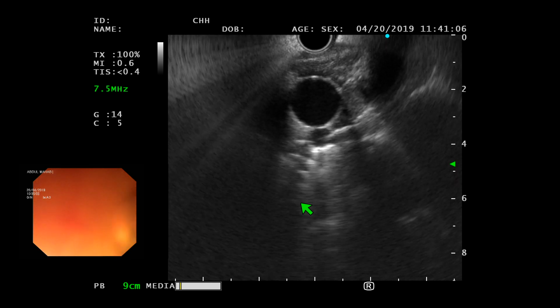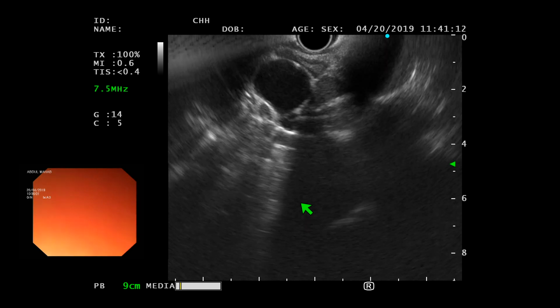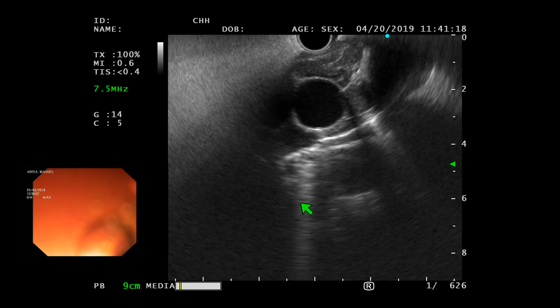When you bring the wheel close to you, just for the audience, see what happens to the lymph node now, and just go big wheel away from you and air away. So this is a decent lymph node again, and to be honest, in the AP window I don't see lymph nodes of this size, can't remember.